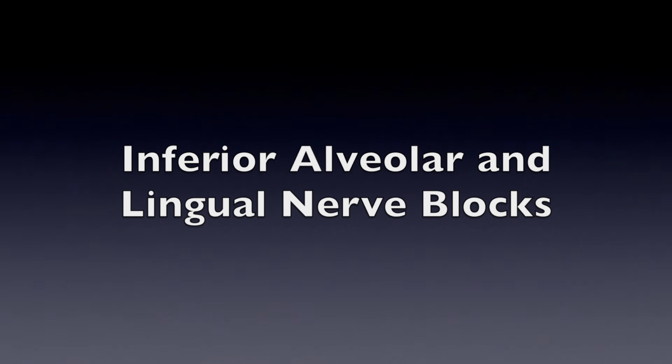Extended verbals for the inferior alveolar and lingual nerve blocks. The medical history has been reviewed, there are no changes, and the vital signs are within normal limits. There are no contraindications for local anesthesia. I will be using 20% benzocaine topical for 1 to 2 minutes, 2% lidocaine with a 1 to 100,000 epinephrine, and an expiration date of January 2018.